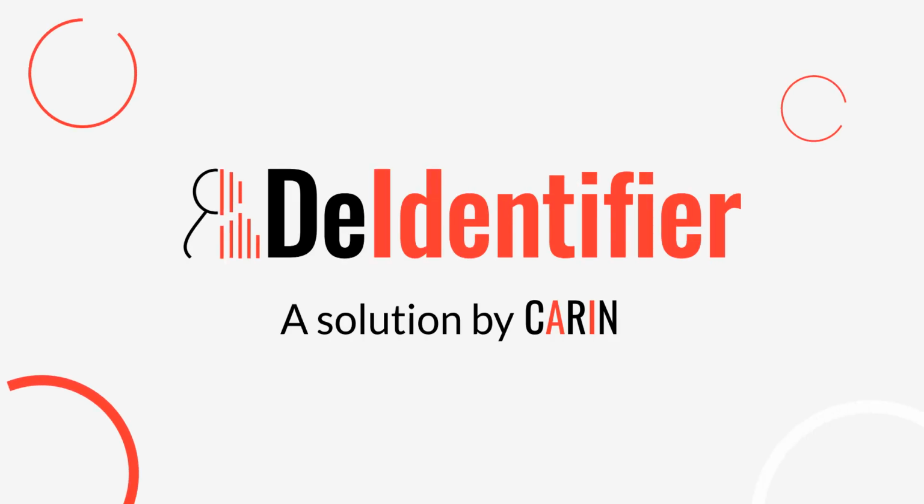For more information regarding batch mode, and any sort of outputs and arguments that are run during the segmentation process, please follow the batch mode instructions for DeIdentifier.